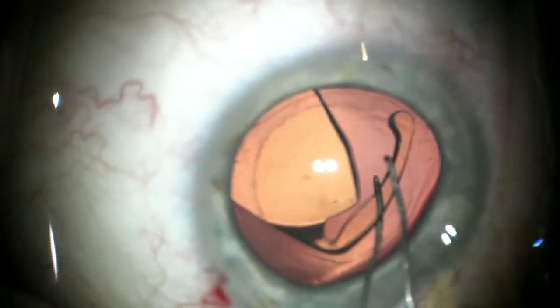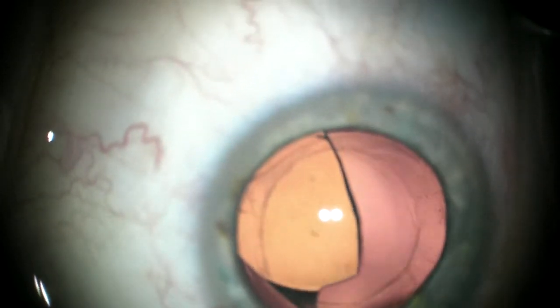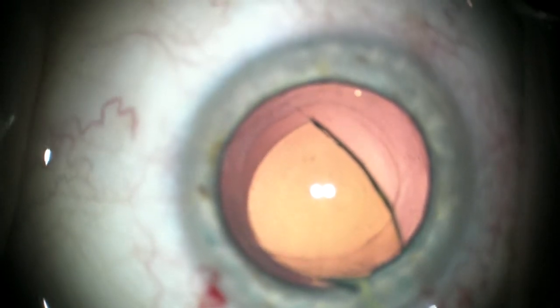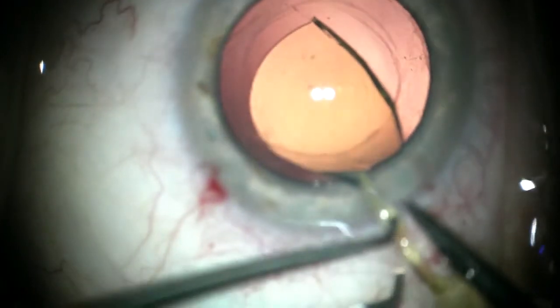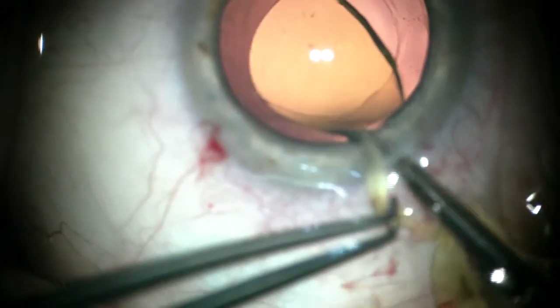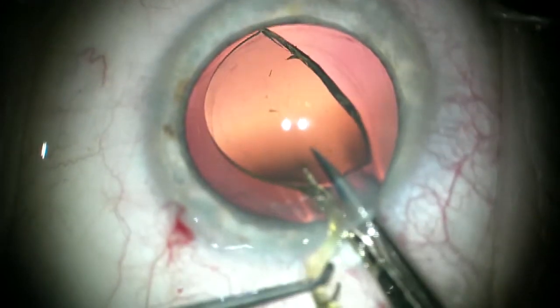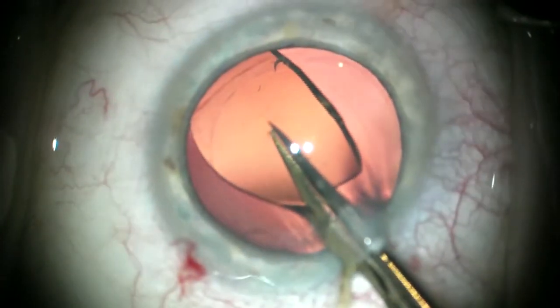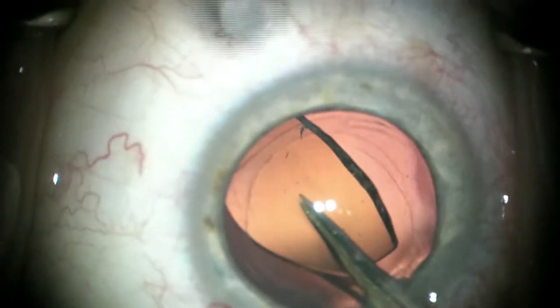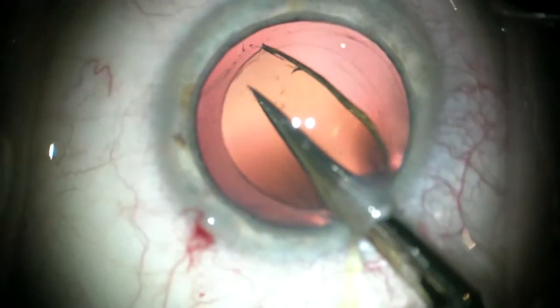Now watch as I go under with a spatula and on top with the Sinski hook, and near the tip pull it out of the incision, then holding it with a toothed forcep — I like the Calibri forcep. Cutting off another third, one has to make sure the jaws of the scissors are vertical, or it will twist that lens up against the cornea and down against the posterior capsule.